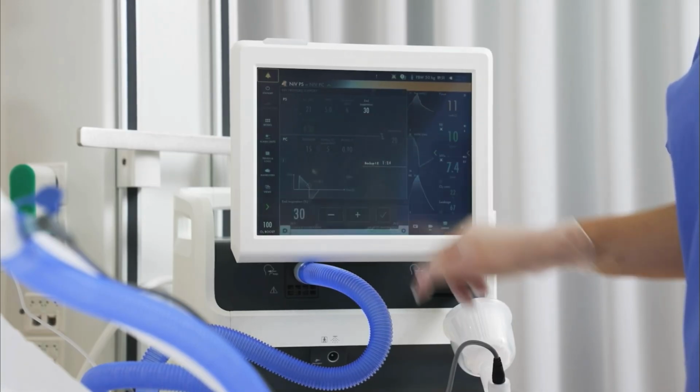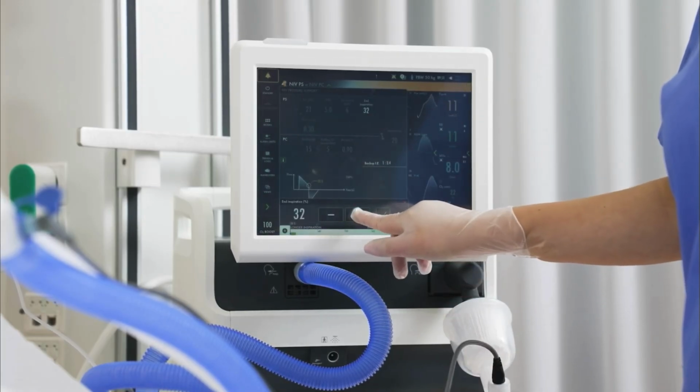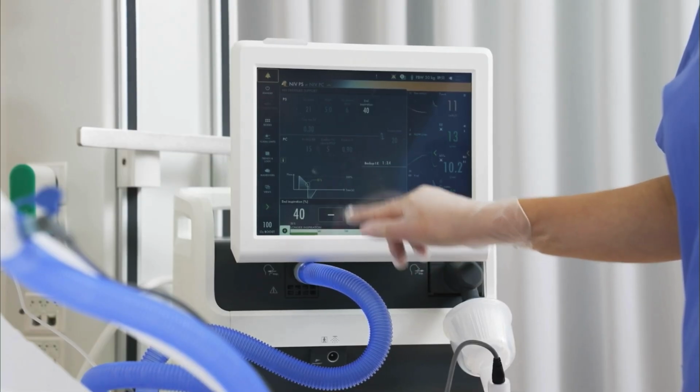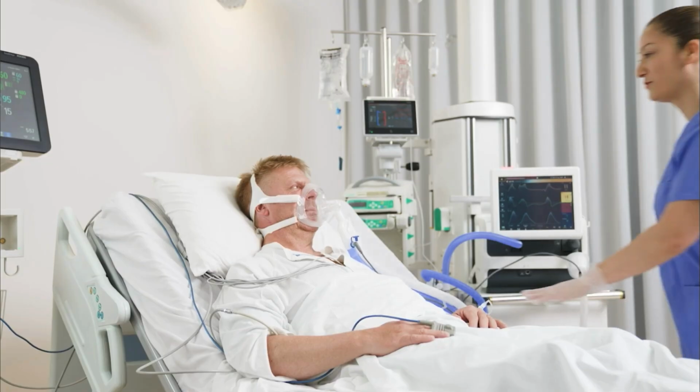The termination of inspiration is determined by the end inspiration setting. This represents the percentage of end inspiratory flow compared to the peak flow. The higher the end inspiration, the shorter the inspiratory phase.